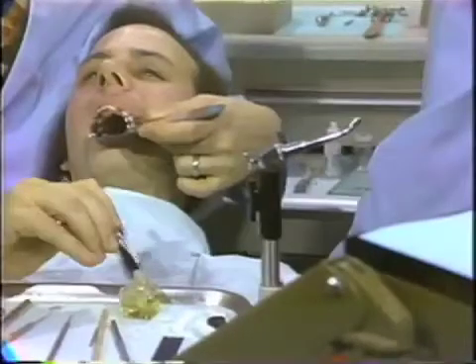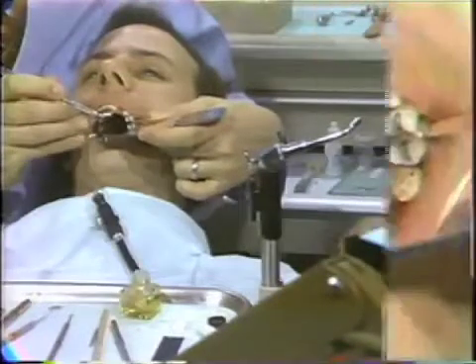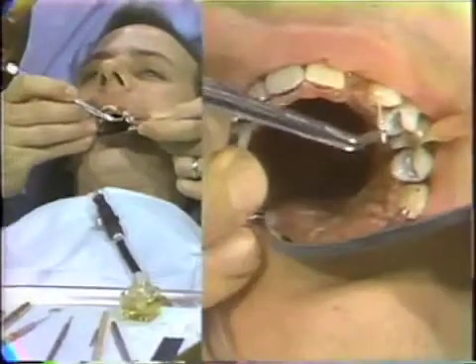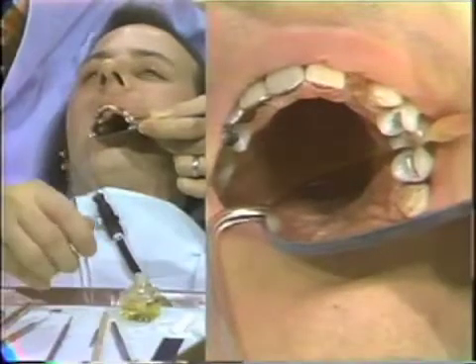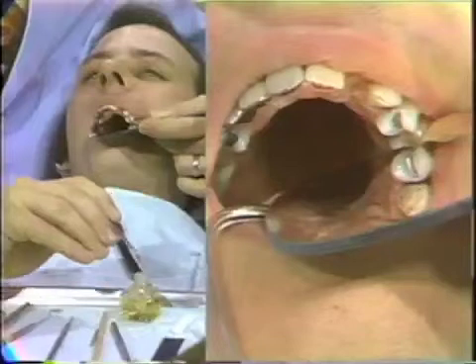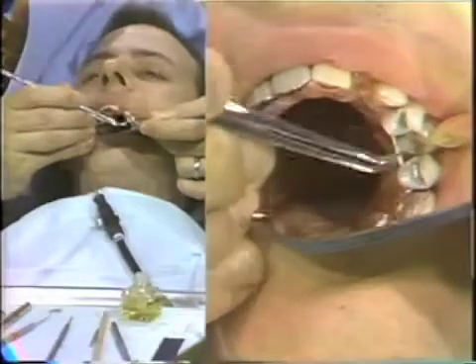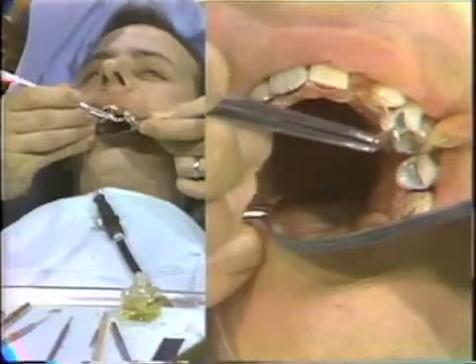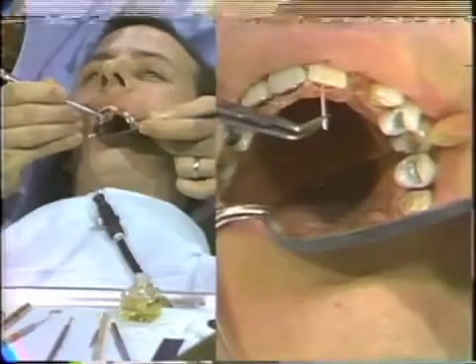In cementing a clinical case with zinc phosphate cement, the pinholes first must be varnished with a copalite varnish. Here we are using cut-off paper points. You'll note we use a fresh paper point each time so we do not contaminate the varnish. It's important that the entire pinhole and the lingual surface are varnished before the bridge is cemented.